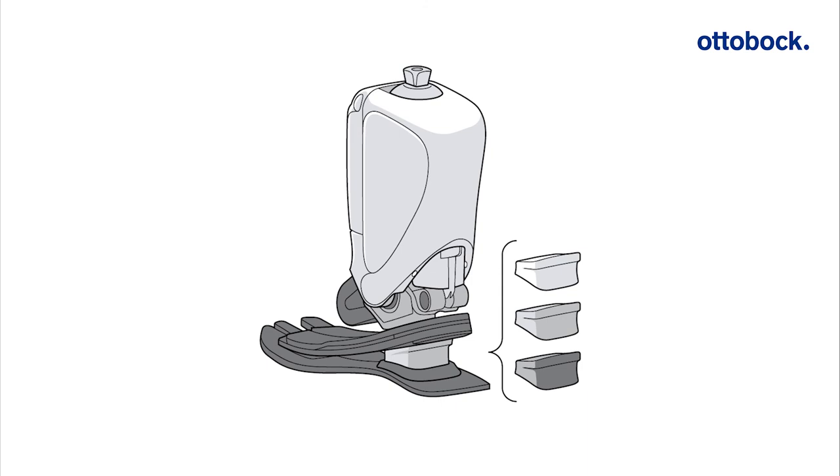The behavior of the prosthetic foot at heel strike and during heel contact in the mid stance phase can be adapted by replacing the heel wedge. Heel wedges of various hardness are included in the scope of delivery. The color of the heel wedge indicates the durometer.